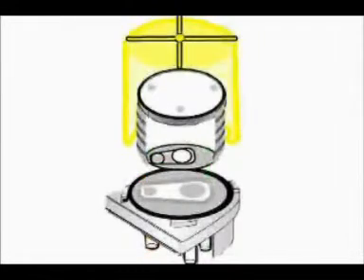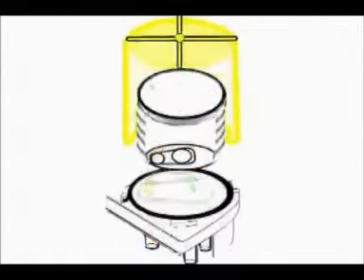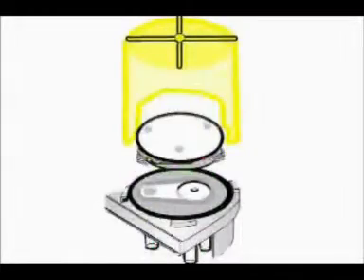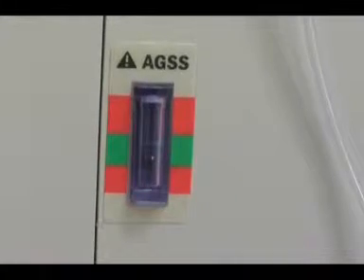The scavenging system will remove waste anesthetic gases from the room. The waste gases are vented through the APL. The system at KUMC is an active scavenging system which is connected to the hospital's vacuum system.